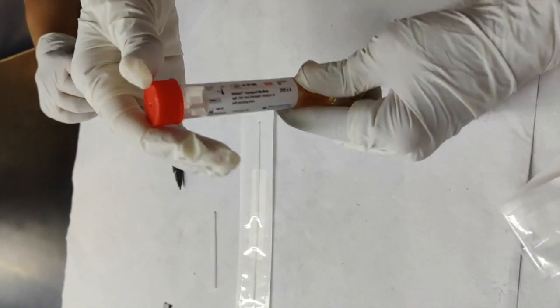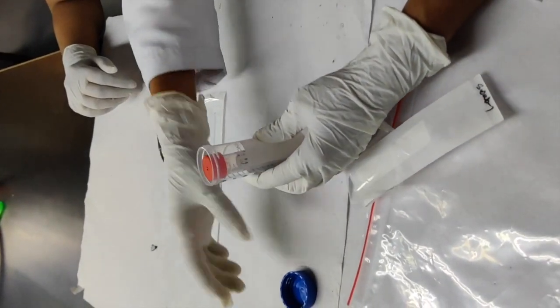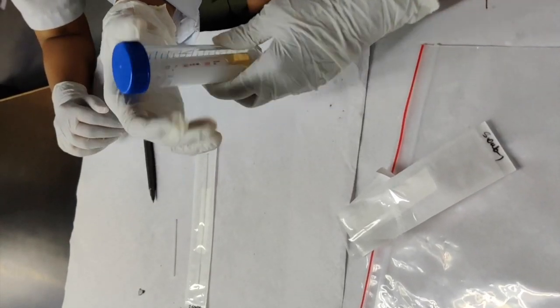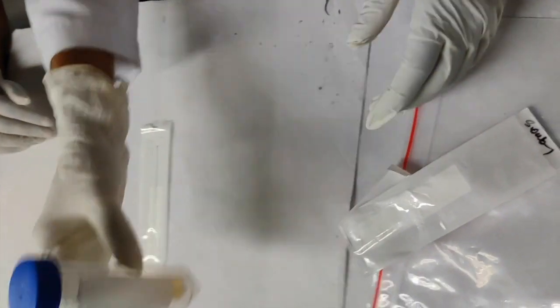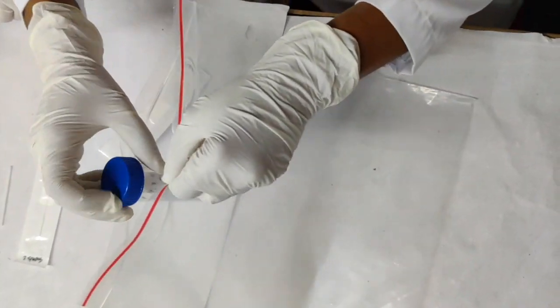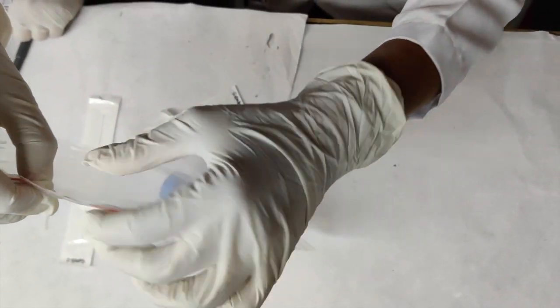The viral transport medium tube containing the swab has to be put back in the larger centrifuge tube, which has to be tightly screwed back so that there is no leakage of the sample. After that, the centrifuge tube has to be put back in the Ziploc bag and has to be sent to the microbiology lab after completely filling the form correctly.